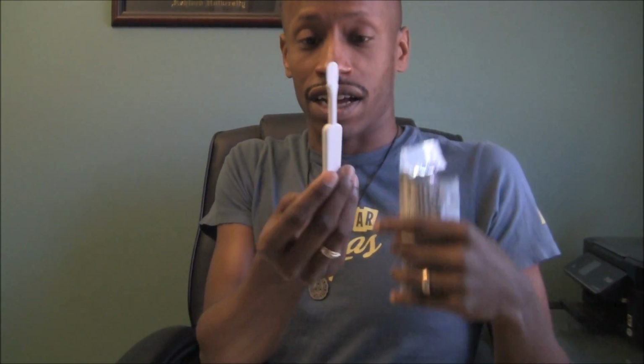Okay, remove test stick. Do not touch the pad with your fingers. So the pad is here on the top, as you can see. And so you don't touch it with your fingers. Not touching. Alright. See next page for oral collection. Okay. Make sure your timer is ready, but do not start it yet.